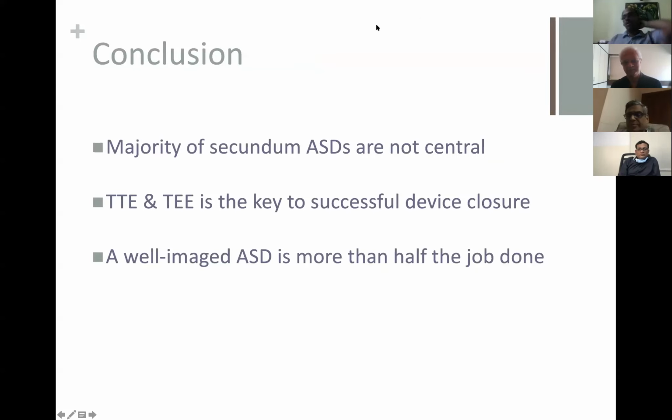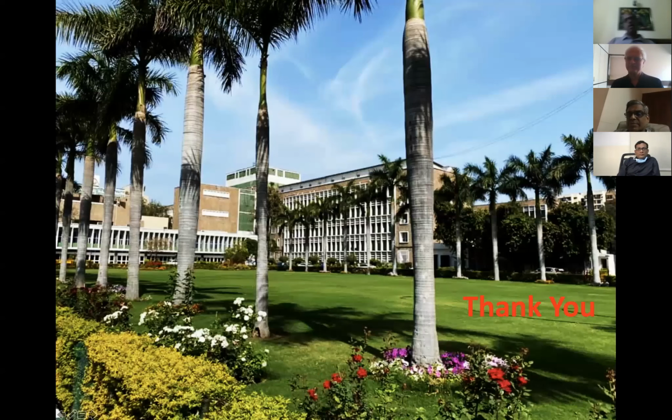True. The consensus probably is that septal length is, number one, a very dynamic measurement, with every cardiac translational movement the septal length is going to vary depending on which phase of the cardiac cycle. And number two, the amount of remodeling of the atria that might happen after we close the atrial septal defect will change the length.